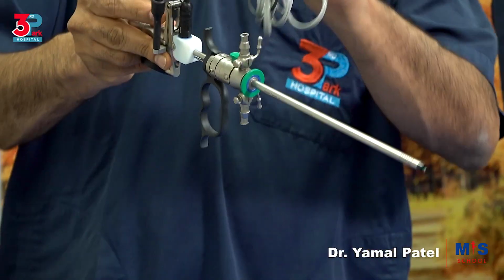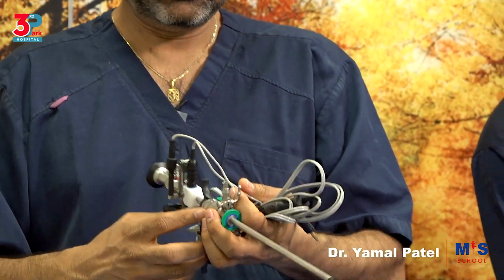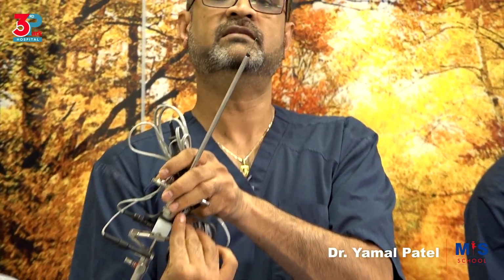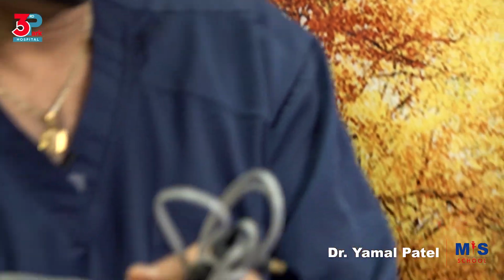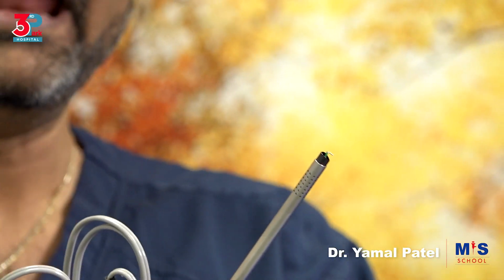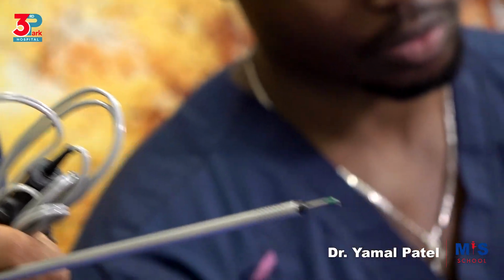So this is now ready for bipolar resection. If you see here, the electrode comes in and out. As you can see, when it is not used, the electrode stays in. When you want to use it is when you would activate it and then come back.